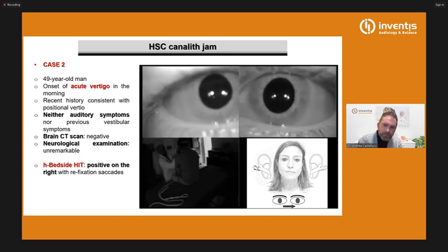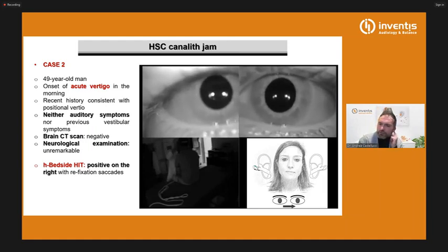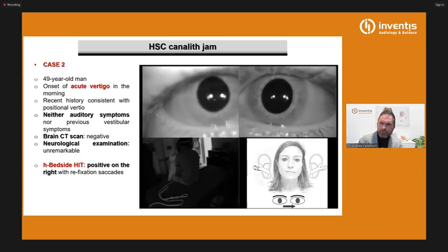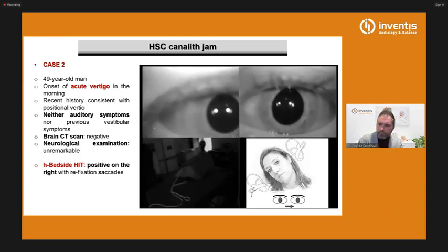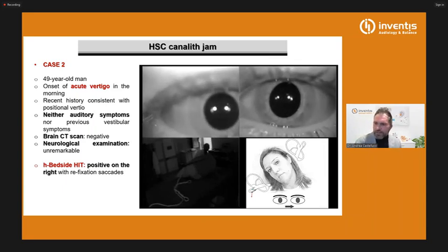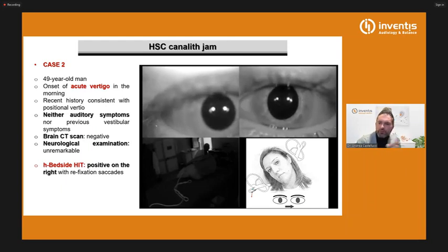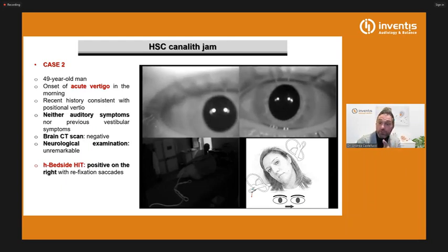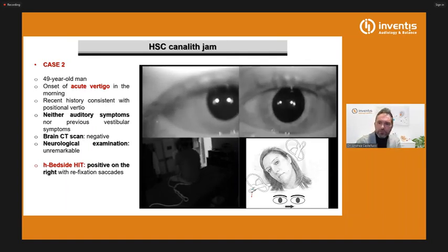But you can see here, now my friend is using the mastoid vibrator, and the vibrator inhibits the spontaneous nystagmus. Look, now he's vibrating and it's inhibited, and it's not very typical. But look, now he's bringing the patient on the right side, and you can see here how the nystagmus reduces. And it's not very typical for a right acute unilateral vestibular loss. Usually, when we put the patient on the affected side, nystagmus increases. Now it decreases.